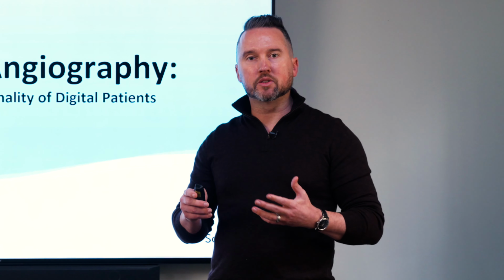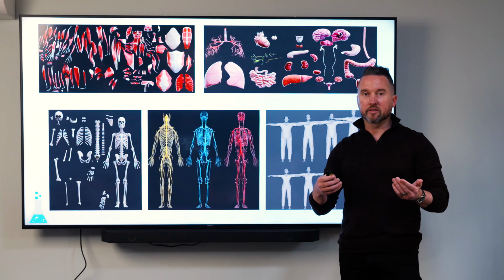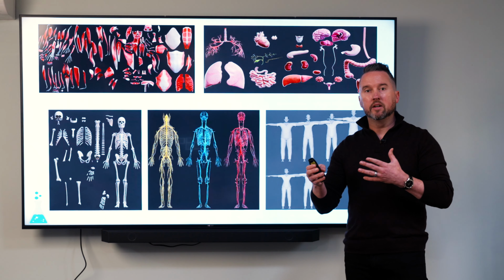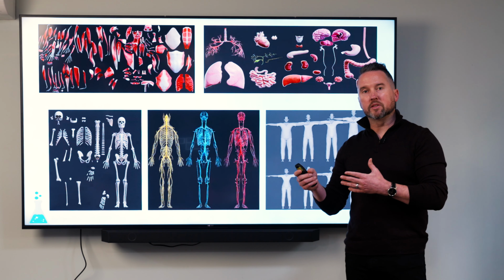So, for anyone who hasn't seen this before, what we really decided to do about 2 years ago was to start creating human simulators. The idea is to mimic the physiology that exists inside of humans and then put that human simulator inside of our simulator. So we can mimic the environment as well as we can, but if we don't have real humans, there's always going to be some sort of shortcoming when it comes to anything that we were developing.